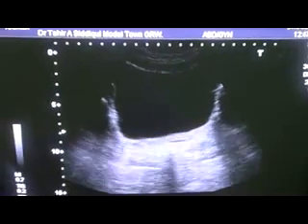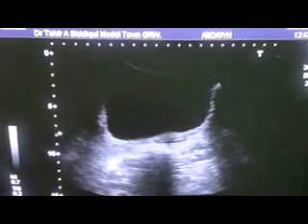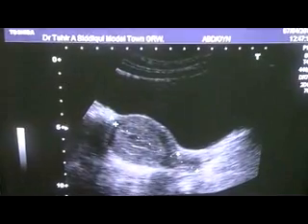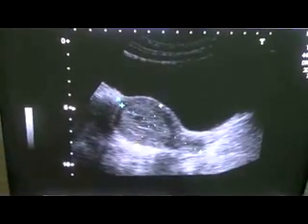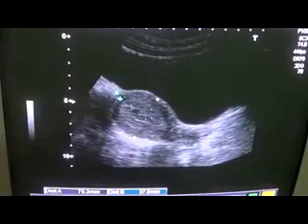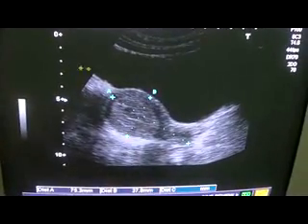This is the ultrasound of a 16-year-old unmarried young girl with a history of menorrhagia. This is the longitudinal section of the uterus and we see it measures 7.5 centimeters in length, 3.7 centimeters in anterior-posterior diameter, and this is the urinary bladder.